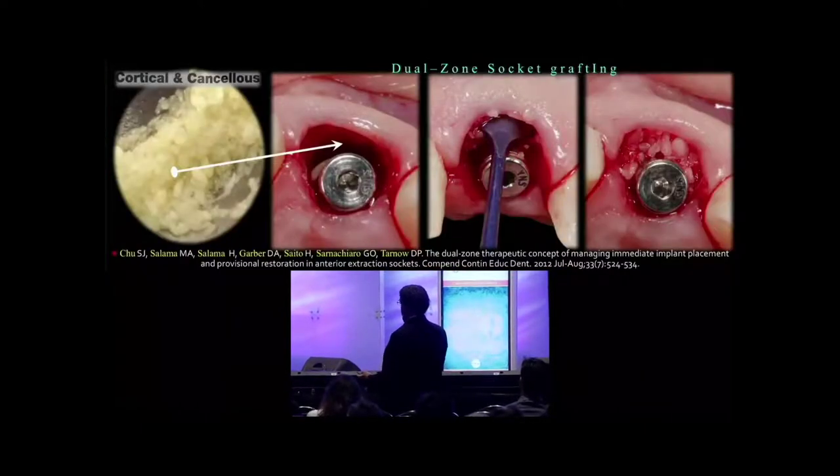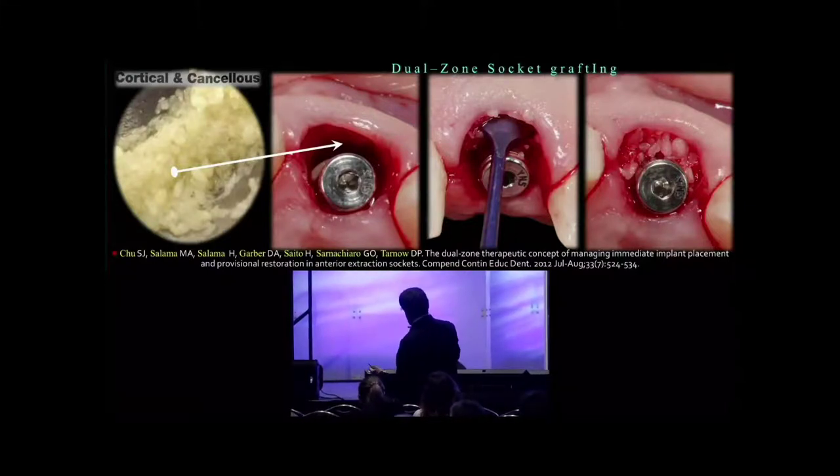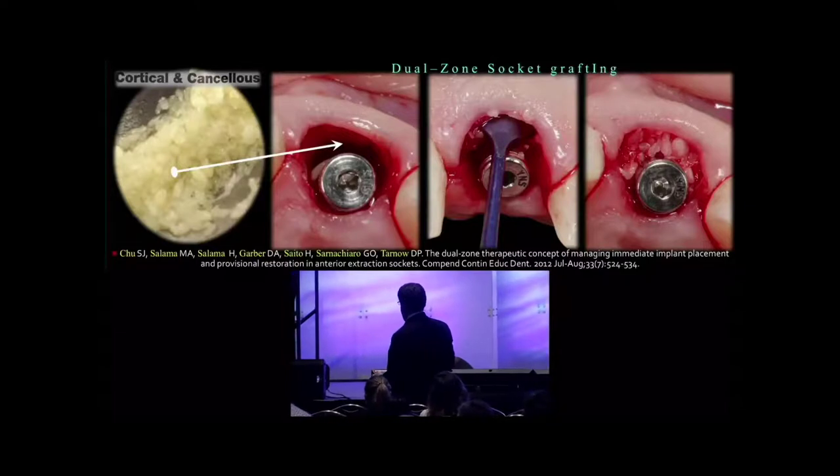Then we pack bone in, as you see here. Small particle mineralized bone right up to the height of tissue. We call this a dual zone socket management because we're grafting not just up to the crest but up to the free gingiva.